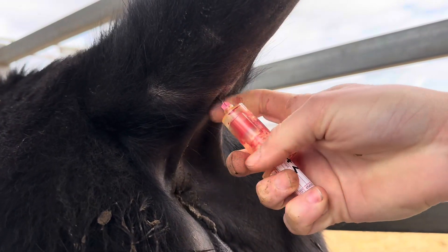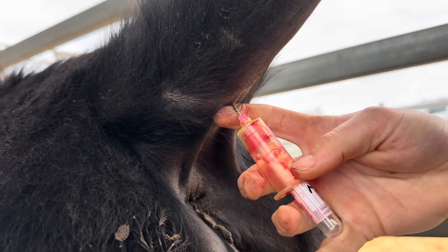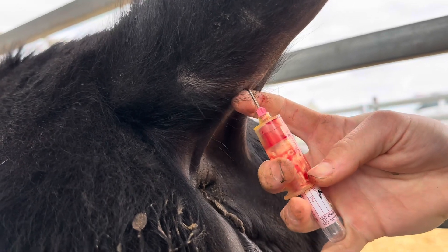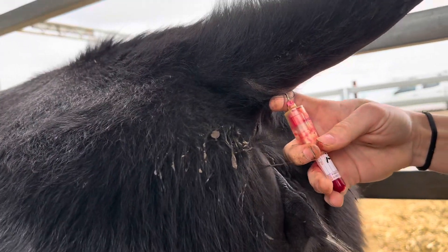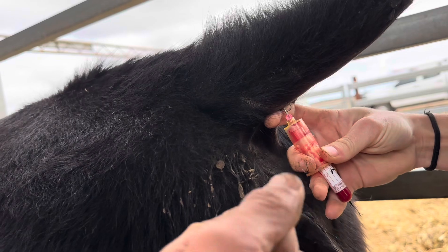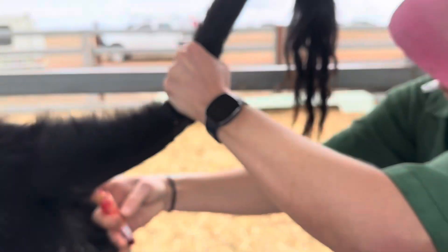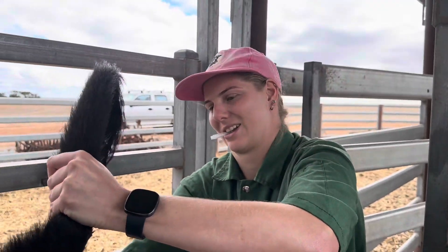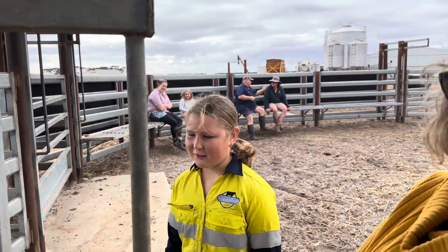Keep your finger up against the needle — like, there you go. See what I mean? Oh, you're pushing hard against the tail with your knee — that's why. See, that was awesome. See how she jumped? And if you'd have been just holding onto the tube like people traditionally do, it would have popped out and blown the vacuum. Good technique. Nice. All good. All smiles. Well played. What do you reckon, Zara? Pretty rad? Super rad!